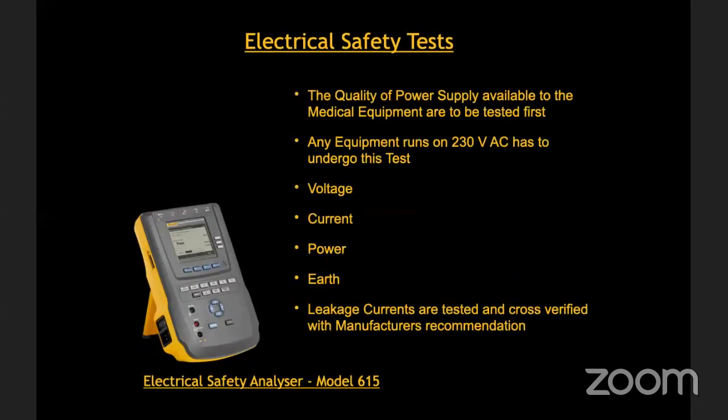Electrical safety is very important, and it's an analyzer. This tells the quality of the power supply in the ICU or in a hospital, because the quality of the power supply is very important for the function of all the biomedical equipment. So the first and foremost is it checks the quality of the power supply from the wall outlets.